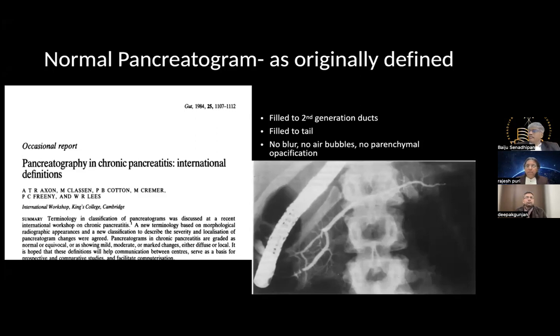And I think now taking the pancreatogram for diagnostic purpose no longer exists. You only do a pancreatogram when you want to do pancreatic endotherapy.